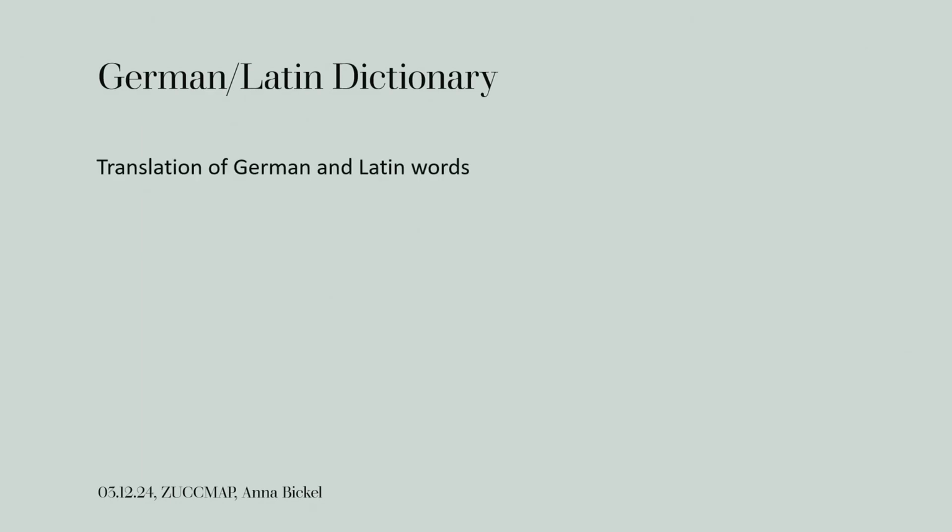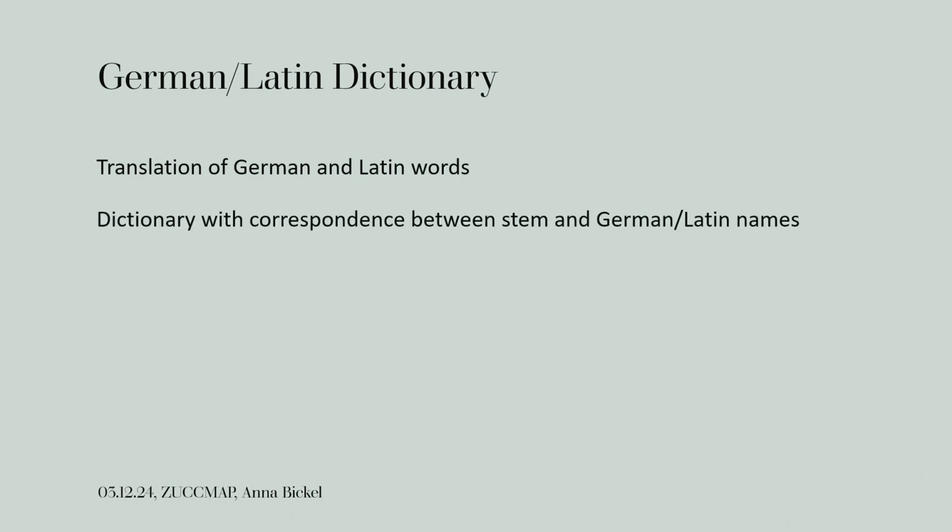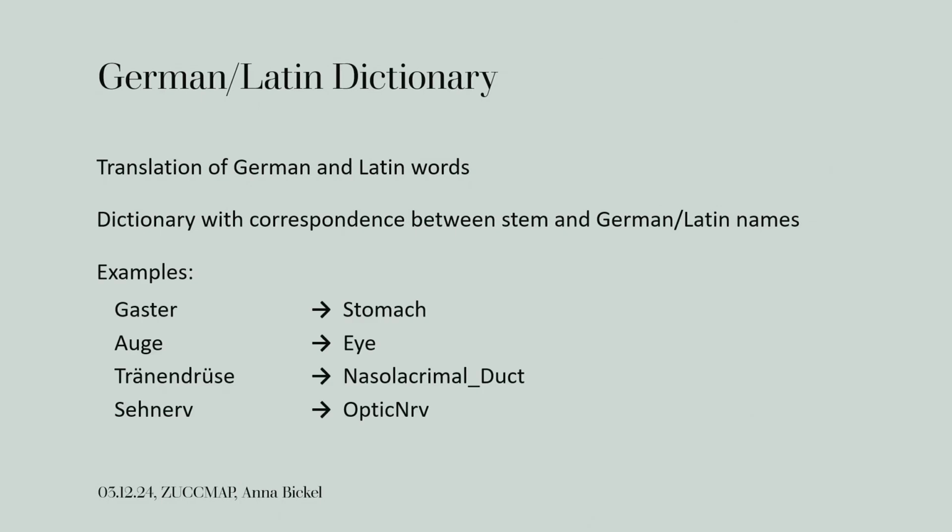First you have to translate these words and find their corresponding name stem. There's a dictionary which decodes it when the code comes across something that cannot be converted. It will then check if the name has to be translated first, and then it will carry out the conversion again if needed.